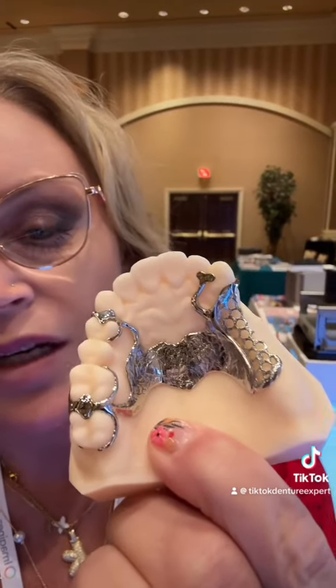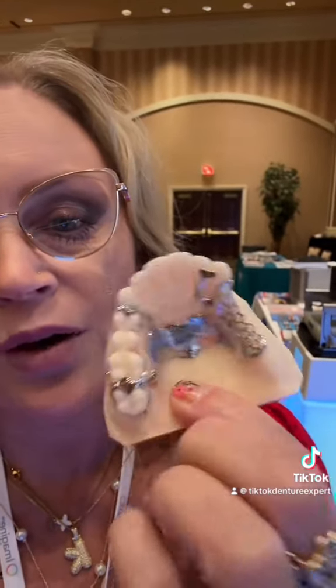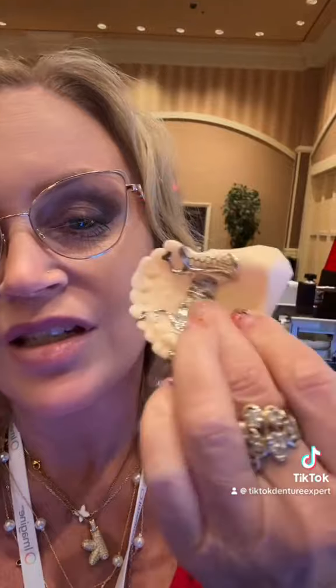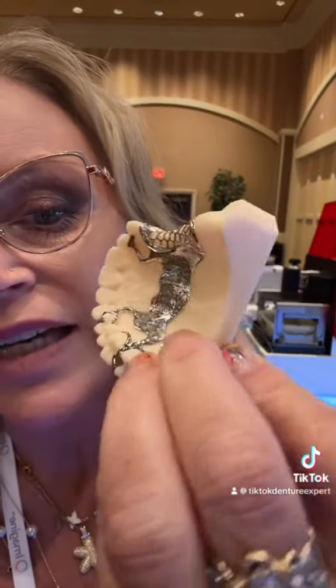This is a really popular one. This is called a palatal strap, and it goes right up against the roof of your mouth, so it really leaves that area up here — this is called the rugi — free, so that the tongue isn't so disrupted. This just sits very, very flat against the roof of the mouth, like so.